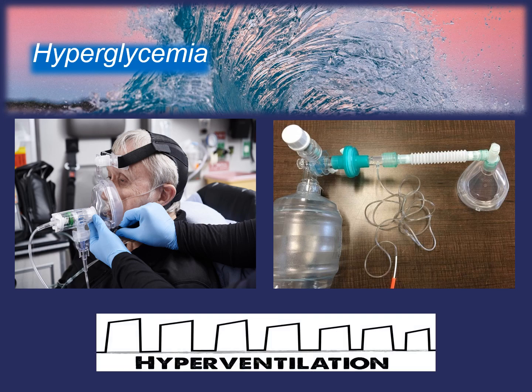If it comes to the point where you need to provide active ventilation, bag fast, however, with lower tidal volumes. Low to moderate PEEP, so that's 5 to 8, and try to keep your end-tidal CO2 low. Aim for whatever reading you had initially, because that is what the patient needs to blow off as much CO2 as possible. If we don't facilitate that, then they will die.